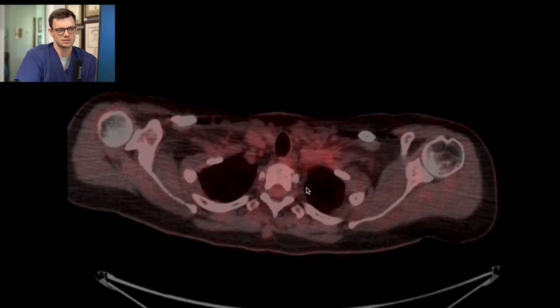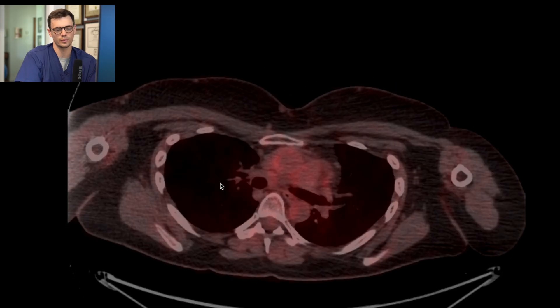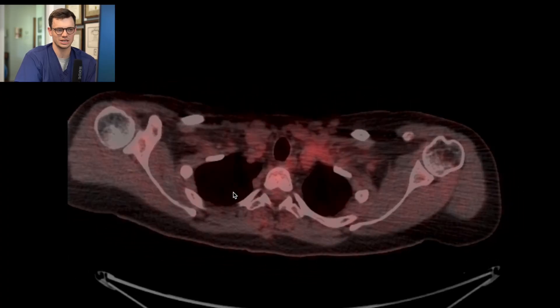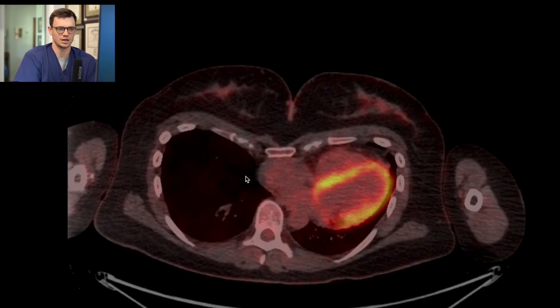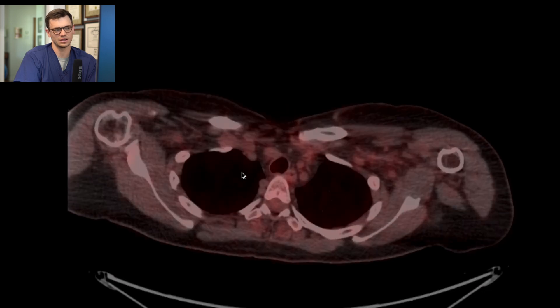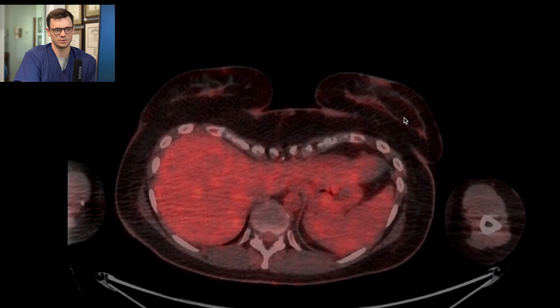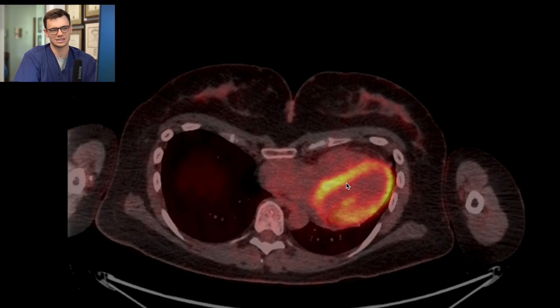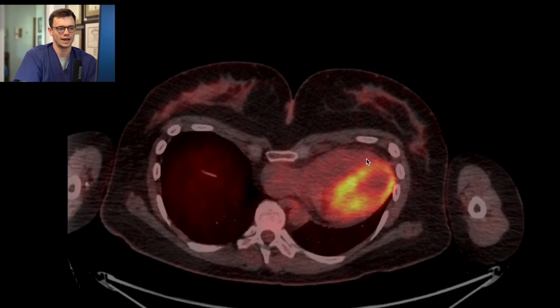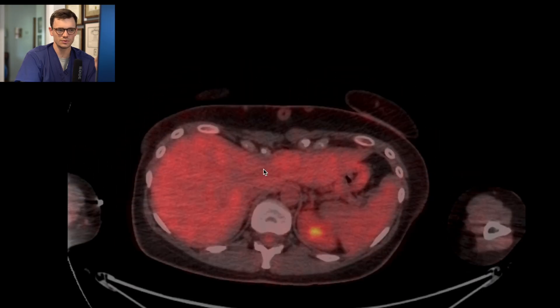I then go and look at the lungs, looking for cannonball-like lesions that are hot — that's a classic look for metastasis. I'd window it differently to look at the lung window for ground glass opacities and consolidation; anything in the lungs can take up tracer, not just metastases. After looking at the lungs, I look at the soft tissues. You can find incidental breast cancers on PET scans. This patient is female and has breast tissue showing low-grade uptake, which is normal. If you saw something focal and hotter — like the intensity of the myocardium — out in the breast, you'd want to bring that up. We don't see that here. I do the bones at the end, so I go down to the abdomen.